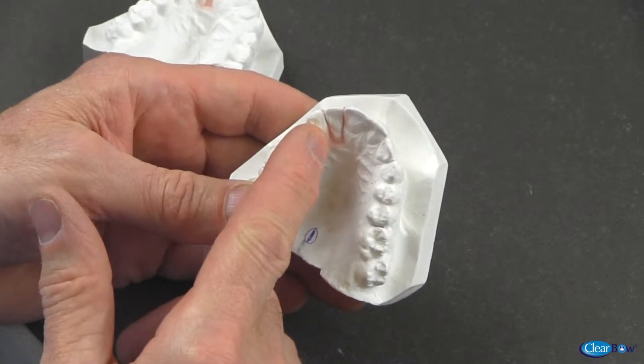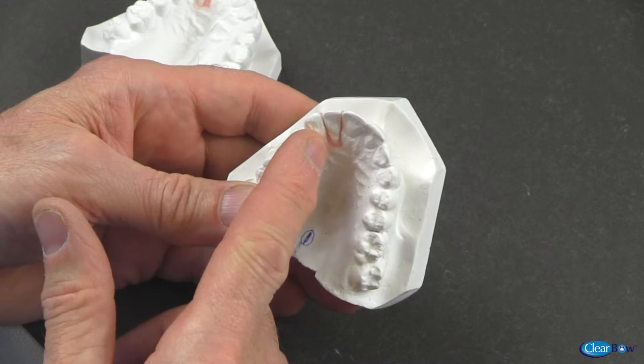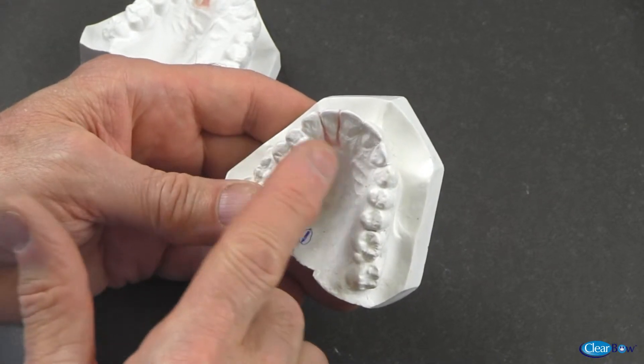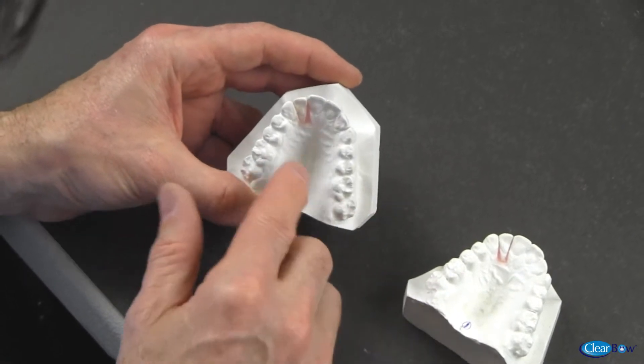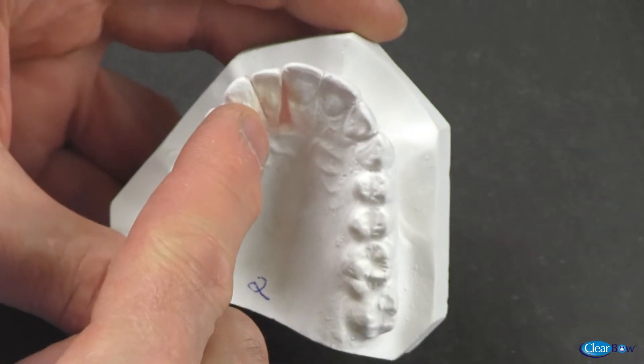On model number one, the upper right lateral tooth has been cut and waxed back into its original position. On model number two, the same lateral tooth has been cut and rotated mesiolingually.